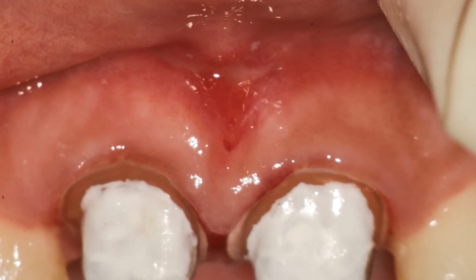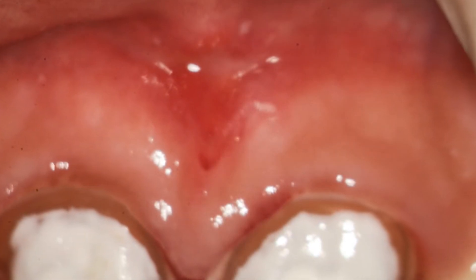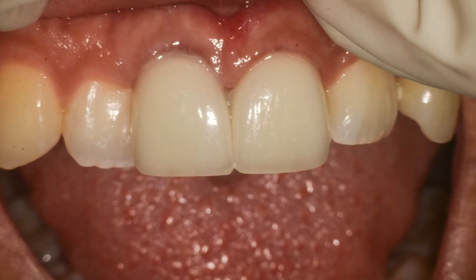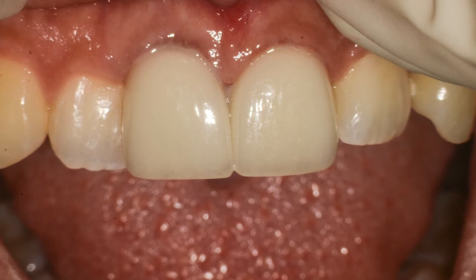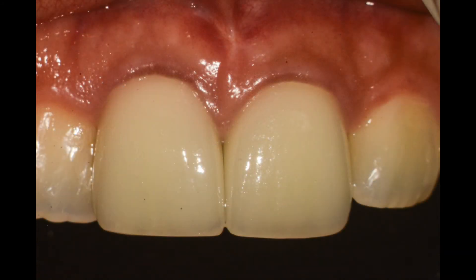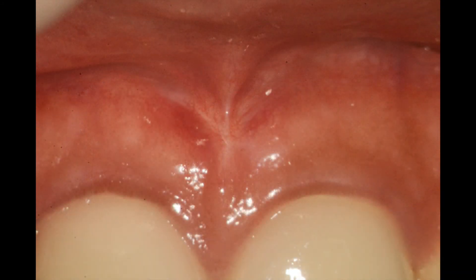Look at the frenectomy here and how well it's healing. It heals by secondary intention, so we sometimes get a little bit of scarring there. We place the two crowns in and give the patient another two weeks to evaluate the new healing. You can see immediately post-op, and here two weeks later — the final post-op view of the frenectomy. This is four weeks afterwards; you can see the beautiful healing.